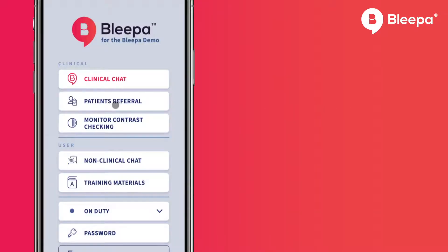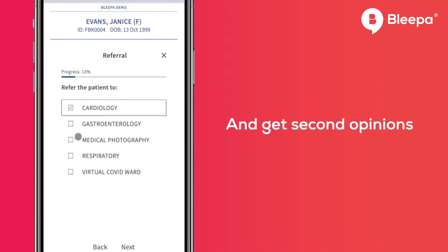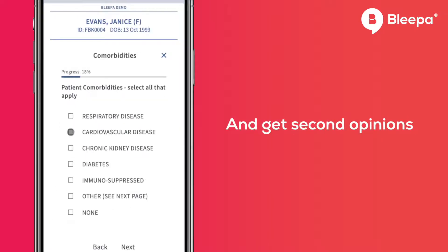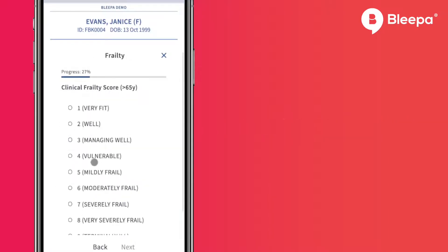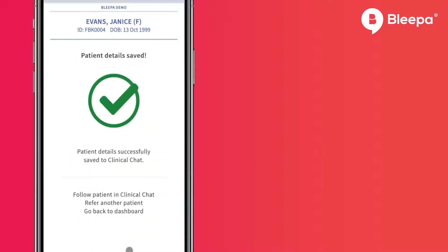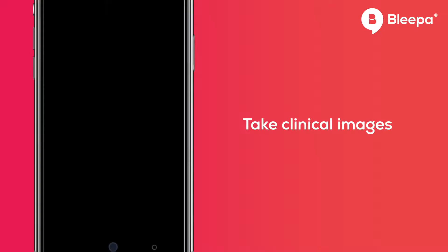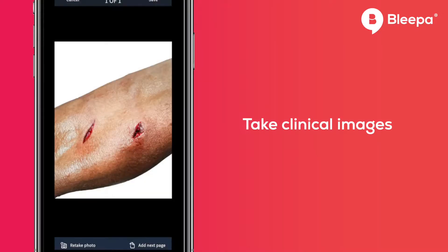Smoothly and quickly manage patient referrals and get second opinions. Discuss cases and gain expert opinions, advice and guidance. Take clinical images to add to the patient record.